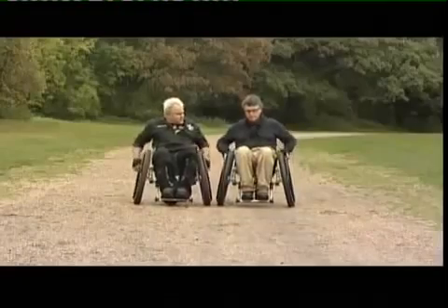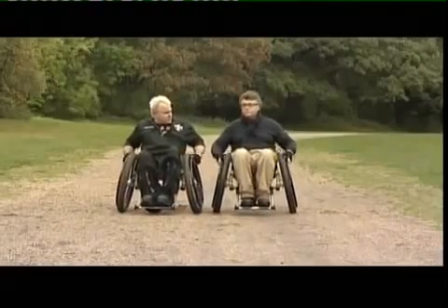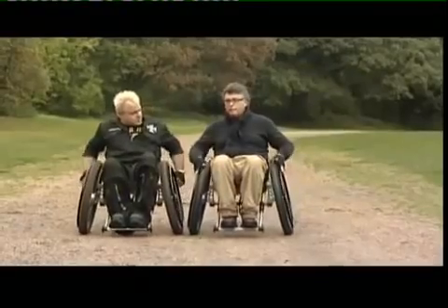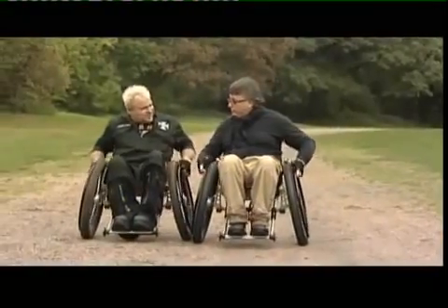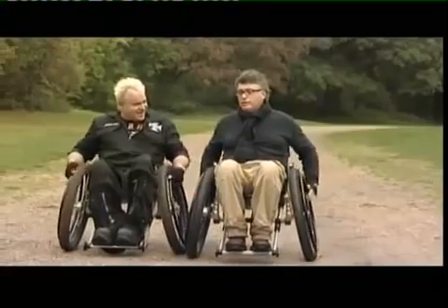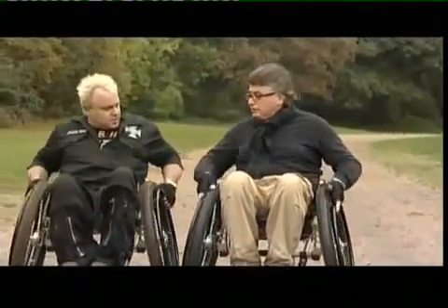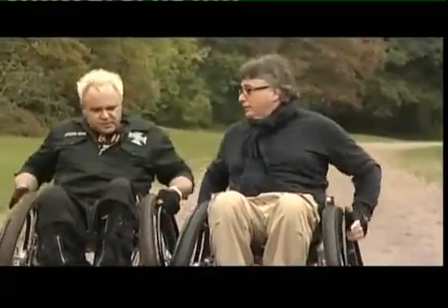But Mike, even at that stage, things still weren't quite right, were they? No, when we first started testing the Trekinetic, it became pretty obvious straight away that it was like twice as fast over rough ground. But the trouble is, as the ground got rougher, it just became more and more unsteady. In fact, it was completely unstable. I felt sick, really. I'd gone from thinking that I'd reinvented the wheel to this kind of really grim realisation we were on the verge of losing everything.